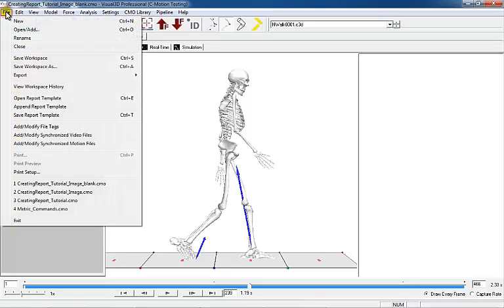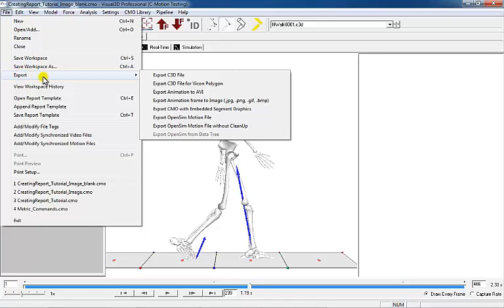Go to File, Export Animation Frame to Image and enter the Export File Name.